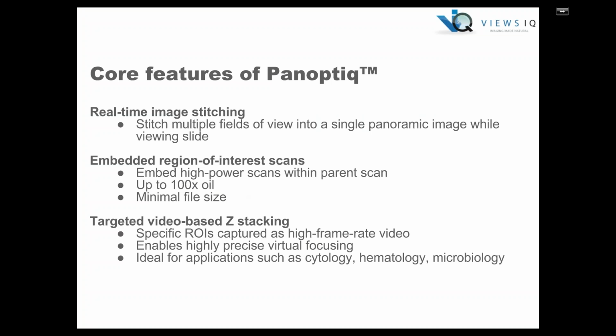And the third key feature is the targeted video-based Z-stacking. As you saw, this allows you to capture specific regions of interest as a high frame rate video that can be played back later to virtually scroll through the focus. And this makes Panoptic ideal for applications like cytology or other disciplines where samples are three-dimensional and where it would typically be very difficult to capture the full detail of the sample using a whole slide scanner.